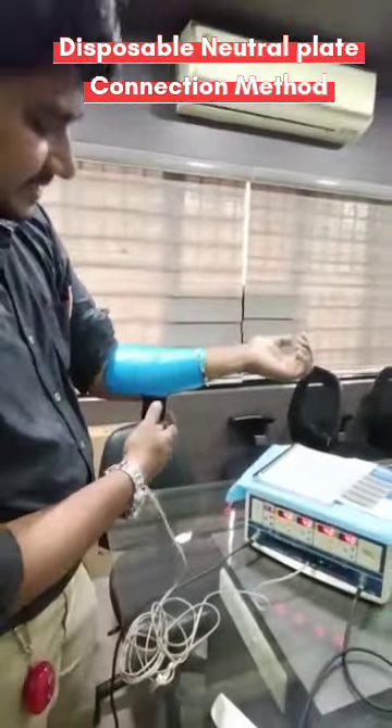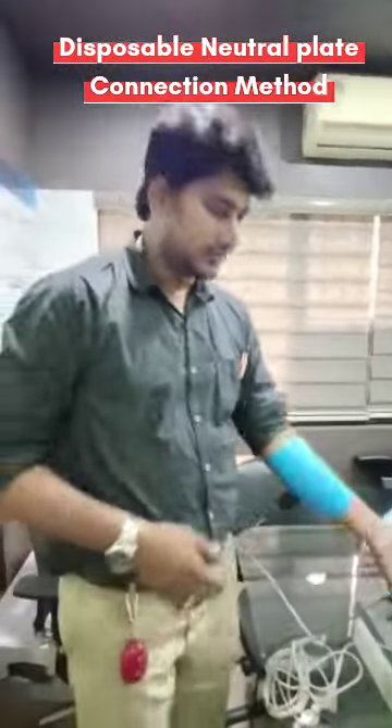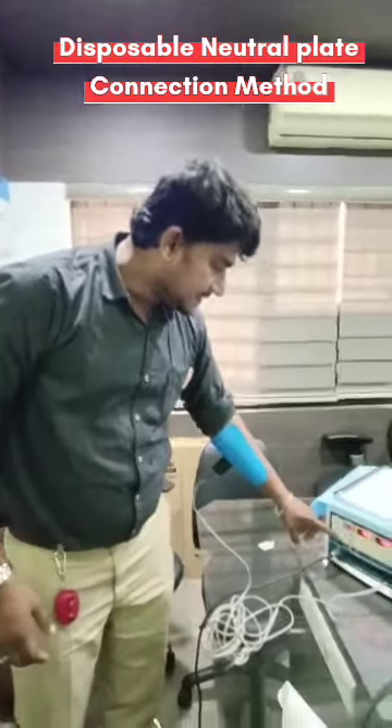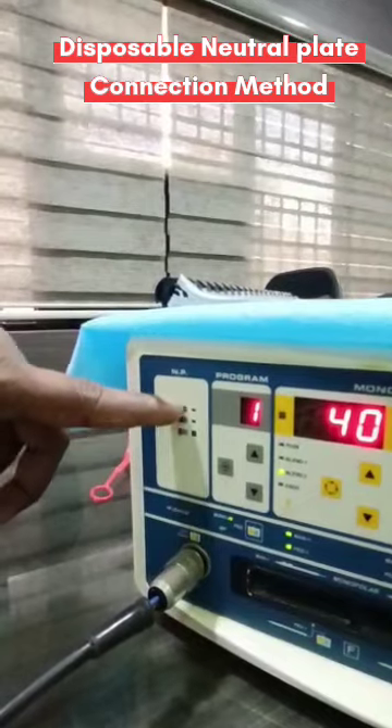Now the machine is connected and shows the indication without any error. In the neutral plate section, you can see three levels of indication: one, two, three.